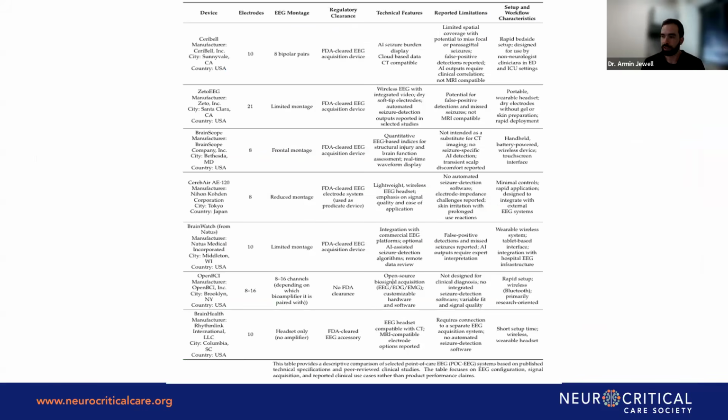So I won't go through this whole table, but just want to show that there are several different point of care EEG technologies out there. And this is a list of just 7 of them, and there's more in the process of being developed. So these are some, and there's different versions of them, different amounts of electrodes for each, different positives and negatives to each. I just want to show that this is, even since 2018, pretty rapidly expanding, and there's numerous of them that are coming out.